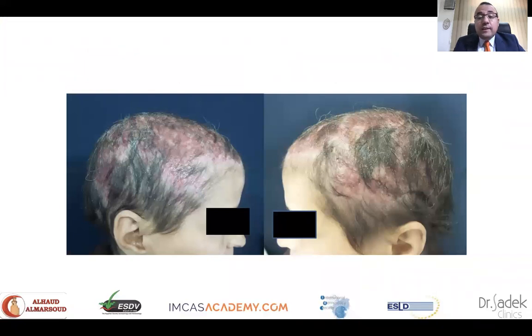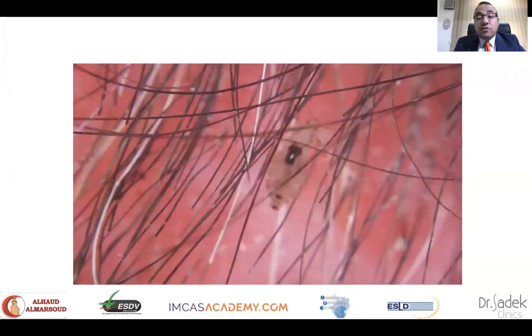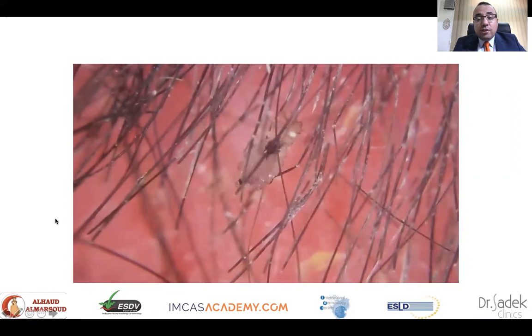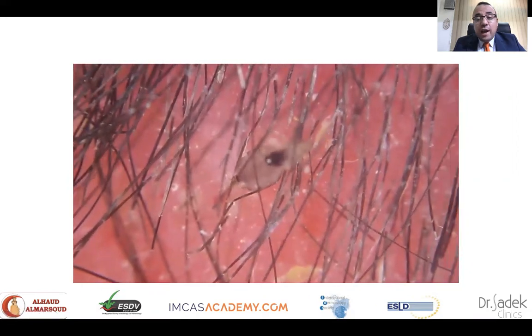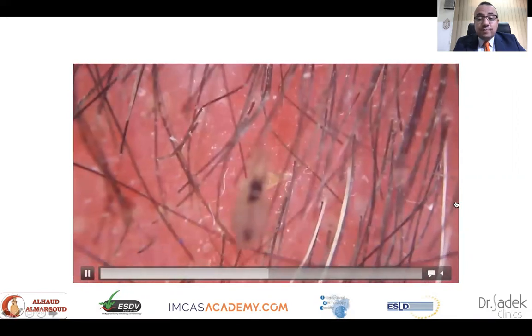You remember this lady where I showed you and I told you there is combined infection of the scalp with nits over there, and sometimes we can see the culprit itself, and if we are rapid enough, we can catch it grasping to the hair shafts and moving over the scalp. Okay.